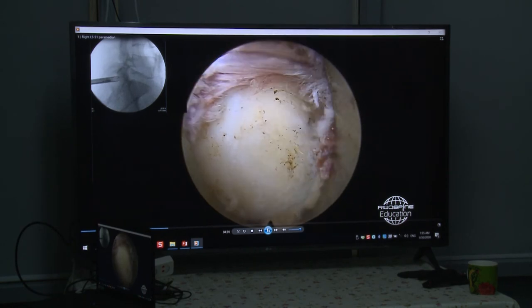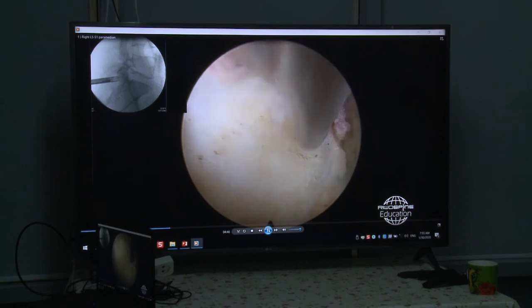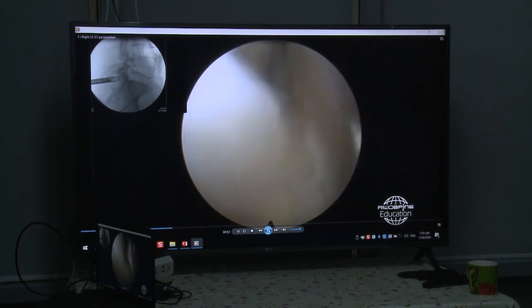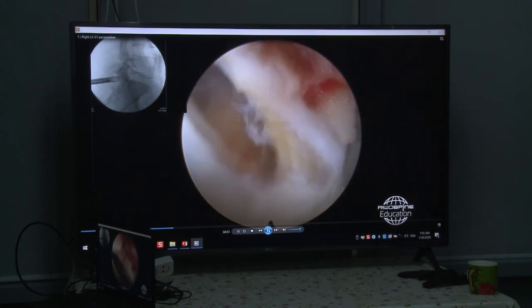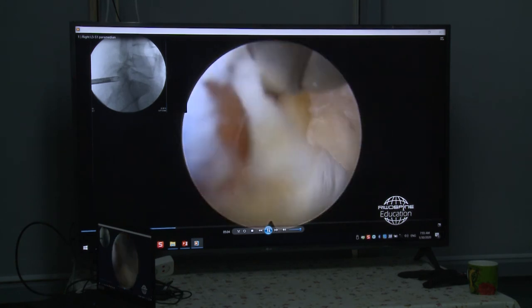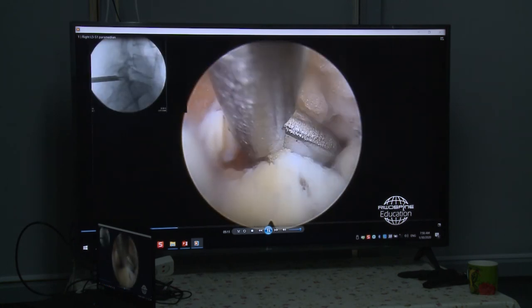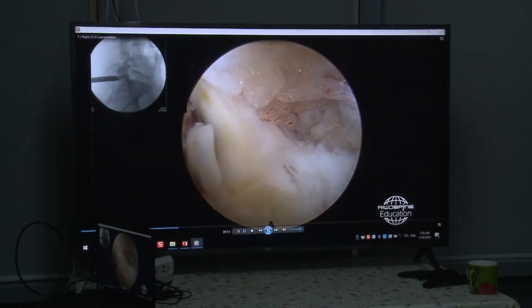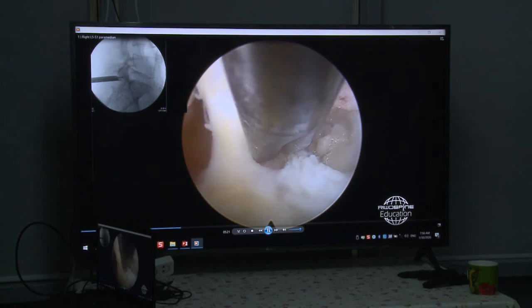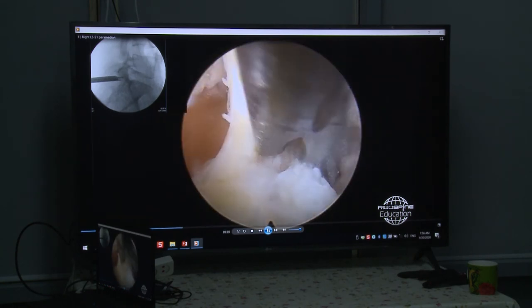The same as for the transforaminal approach. When I put in the instrument, I cannot see what I'm doing, so I have to rotate the endoscope. So I opened it already. Now I use the cannula to stretch the flavum ligament. Check again in X-ray. Okay, the direction is correct to the disc base. Here laterally, the fat tissue we see is from the joint. That is the deep layer of the flavum ligament. The deep layer inserts at the medial margin of the ascending facet. Here is the superficial layer, which inserts at the medial aspect of the descending facet. So I cut the deep layer.